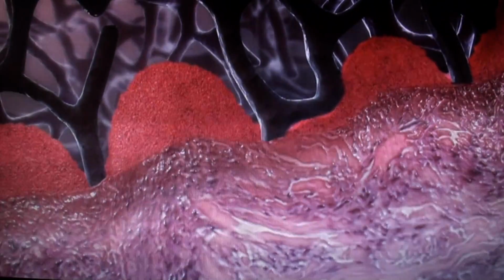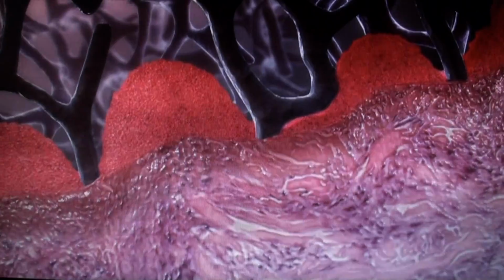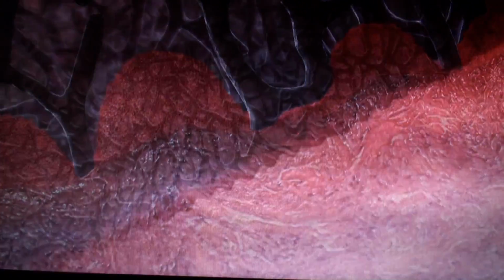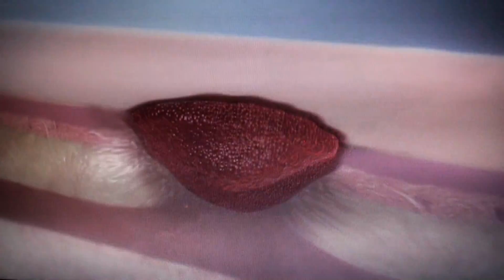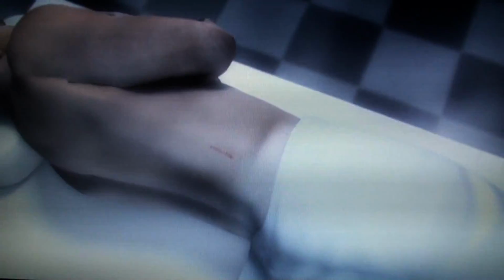All of this cellular activity leads to the formation of healthy granulation tissue in the wound bed, and the characteristic undulations that have been seen in wounds treated with VAC therapy. Over subsequent dressing changes, the granulation tissue fills the wound bed, further reducing the volume and preparing it for final closure by secondary or delayed primary intention.